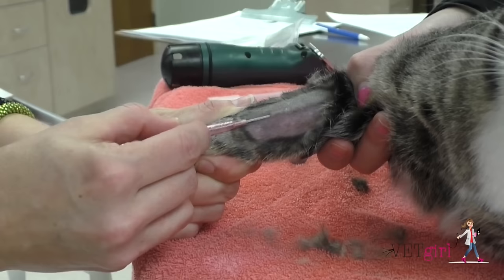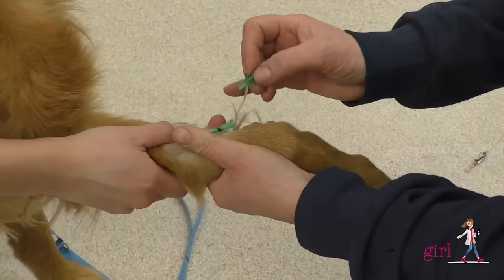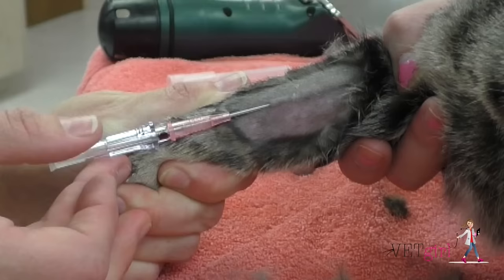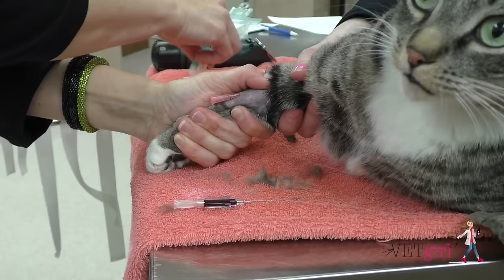The bevel of the catheter should ideally be facing upwards. The non-dominant hand should be used to restrain the distal limb simultaneously. Ideally, the vein should be catheterized as distal as possible within the sterile field to allow for multiple attempts of catheterization if needed. Once blood starts to fill the hub, the catheter should be slowly inserted parallel to the vein in small millimeter increments to seat the catheter directly into the vein.